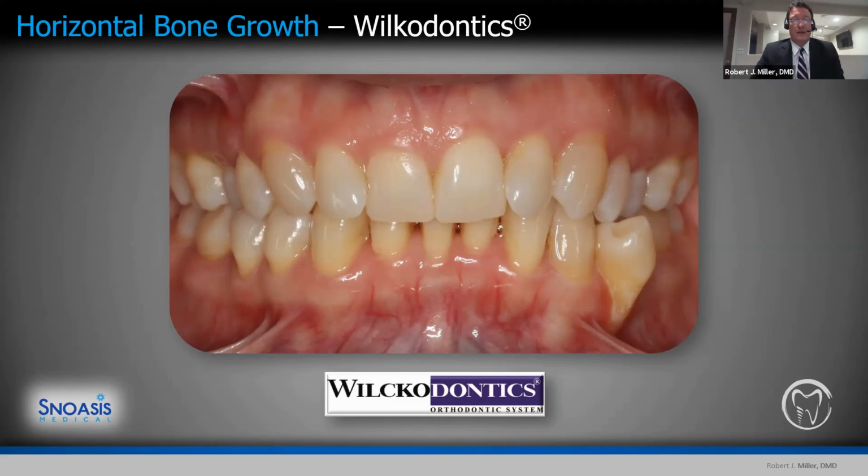Okay, a little bit outside of the box. I've been a fan of the Amnion-Chorion membrane for 9 years now. And so every now and then I start seeing new applications for the BioXclude barrier membrane, using it for sinuses. I used to just use it for small tears, small perforations.